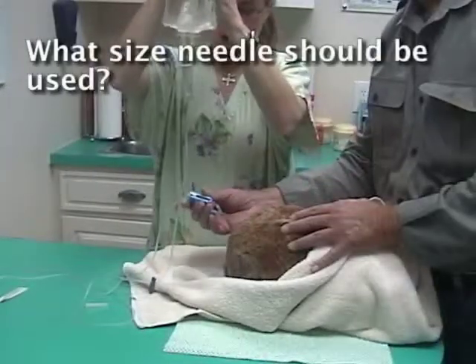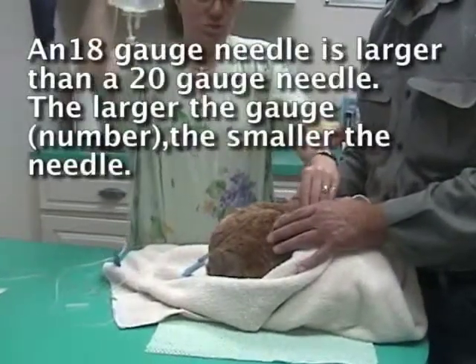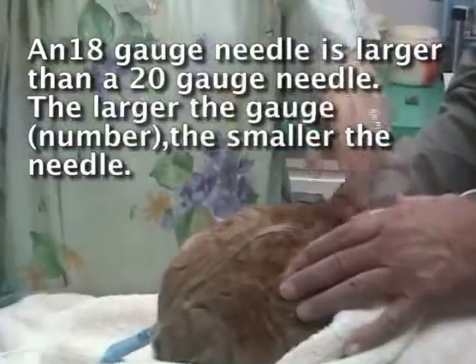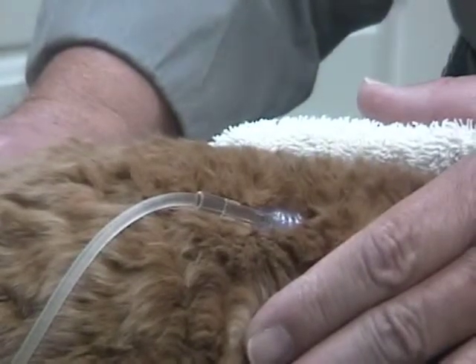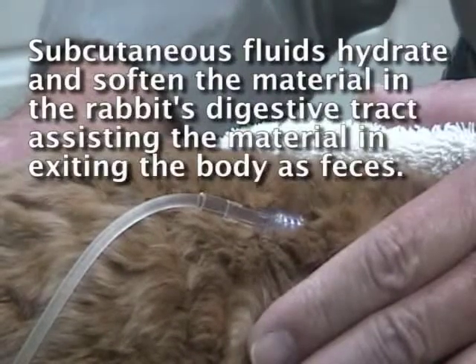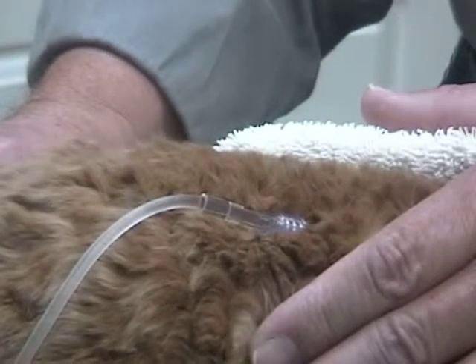On a rabbit this high, I would use an 18 gauge. On a smaller rabbit, I would go with a 20. But the smaller you go, the harder it is to get the fluid in. When a gut slows down or stops, the material dries out. The material in the stomach and the gut dries out, and this helps not only hydrate the animal but hydrate the food to pass.